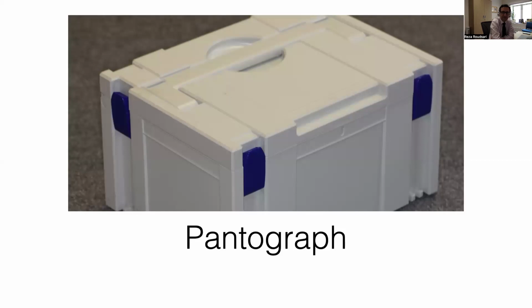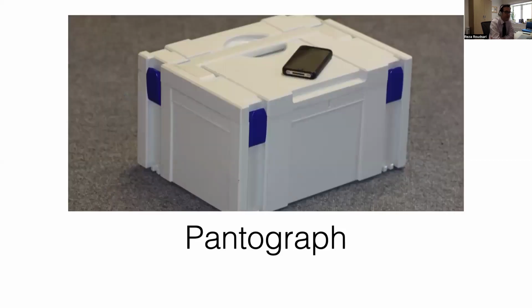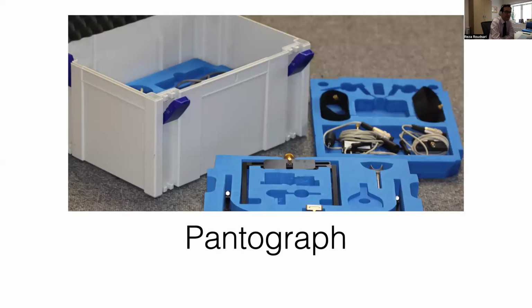And we do have this one at the dental hospital, and I've used it probably twice in my life. And just to give you an idea, this is my iPhone on top of the pantograph, just to give you a kind of context into the size of the box. And then when you open the box, you will have 3 different layers of instruments all set within.